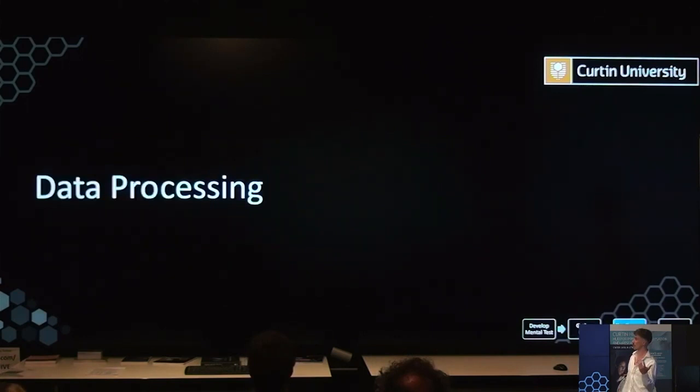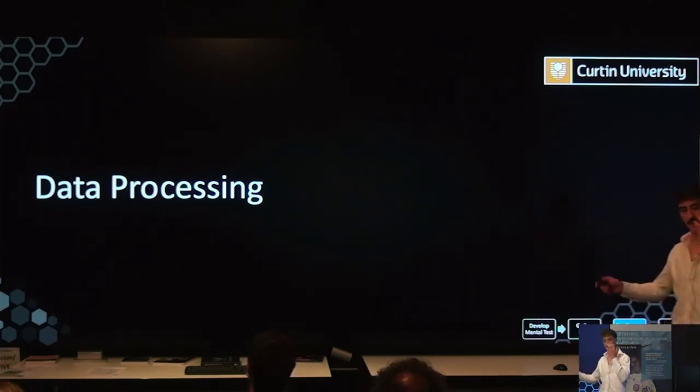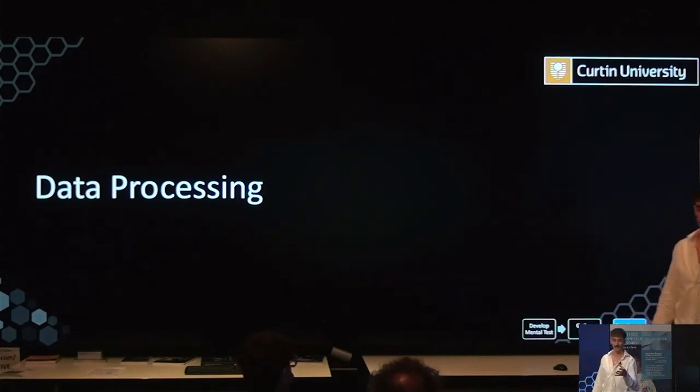Yeah, so what we've done there, we've conducted the experiment, we can then bring it through to processing. And the first stage of this processing is to take our data and start cleaning it up. Basically because the device is quite sensitive. It's sensitive enough to pick up things like movement, whether that's movement of the body, or more particularly movement in the eyebrows being quite intrusive, or even things like the breath or heartbeat in the signal.